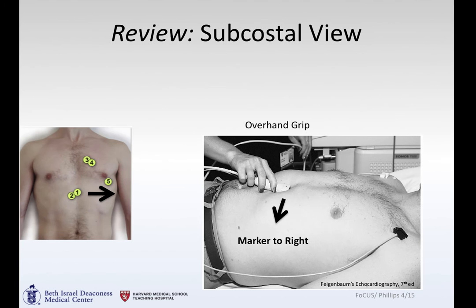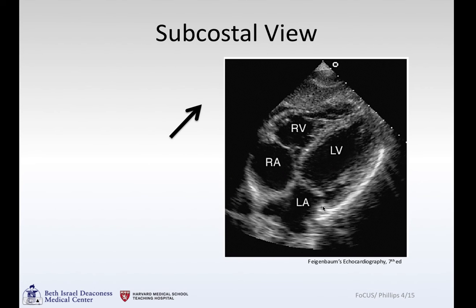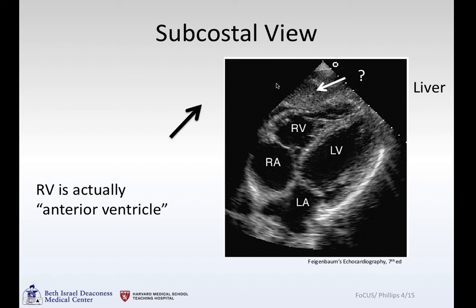Review from last time: the subcostal view — using your overhand grip, marker towards the right, coming underneath the ribs — opens up the heart. You're seeing first the right ventricle, right atrium, left ventricle, left atrium. And do not be fooled: this is the liver, not a large effusion. The pericardium you can see is a bright line.